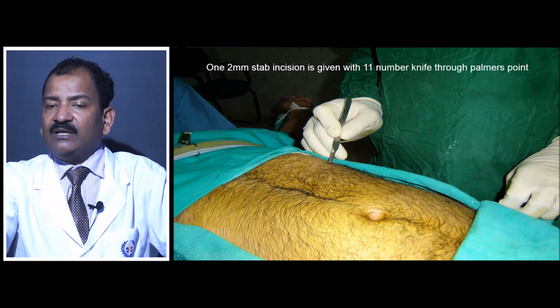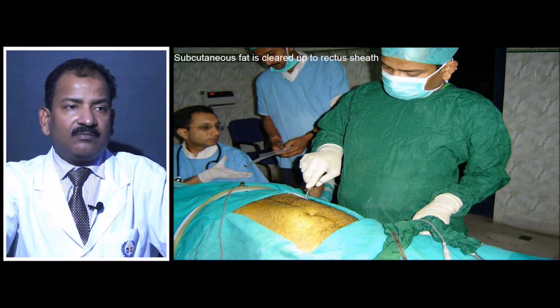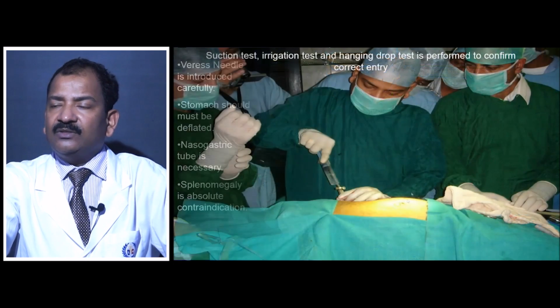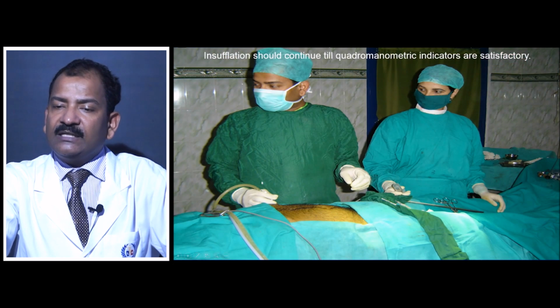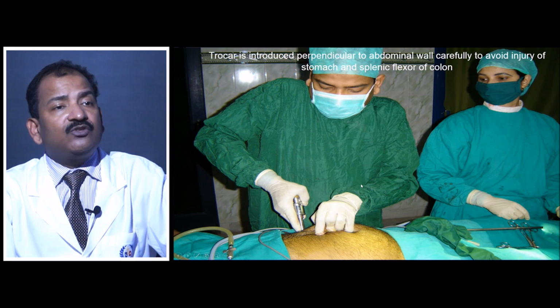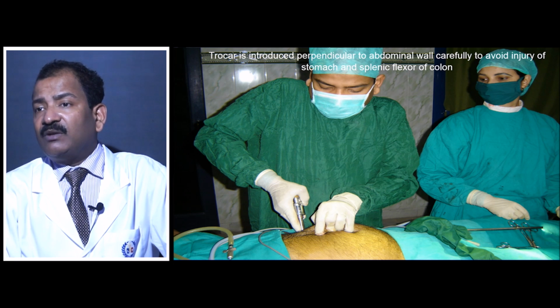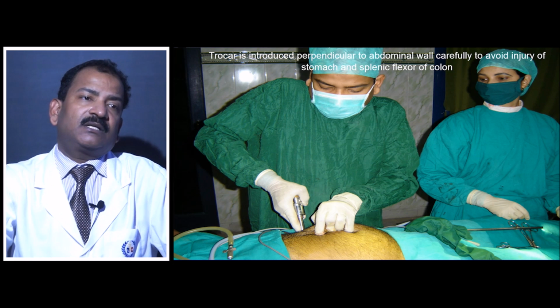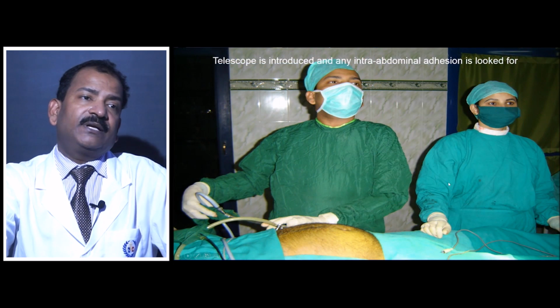So, you take a number 11 knife, and put in one mosquito clamp, then you take a Veress needle and introduce it, then you do suction, irrigation and the hanging drop test, and then you start Veress needle insufflation. Then you take a trocar, and the trocar should be pointed towards the stomach. It looks like you want to perforate the stomach. So, it should be directly pointed towards the stomach, and after that you will enter inside, and then you will put in a telescope.